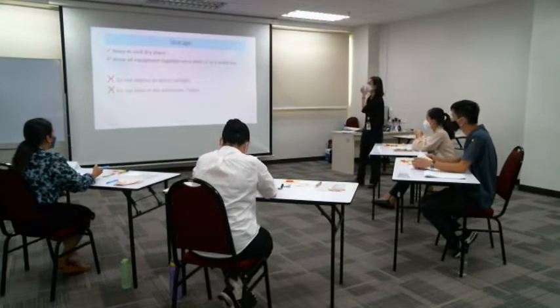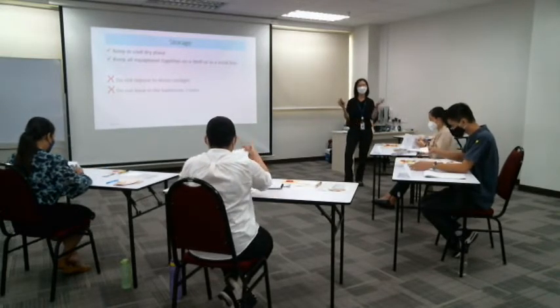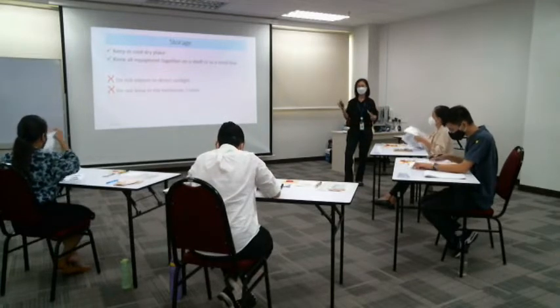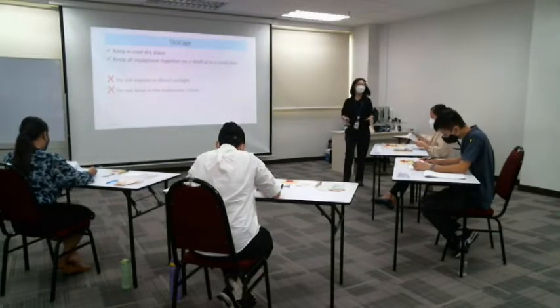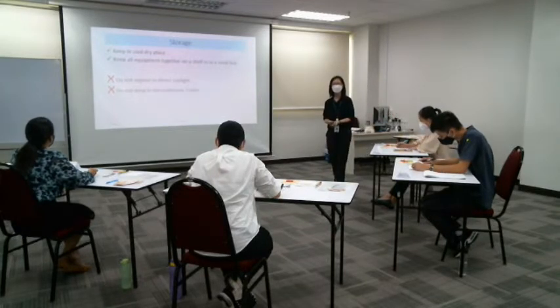Okay, so you know about the appliances, you know about the pouching system, one piece and two piece. Then the storage of all this. So how are you going to educate your patient?